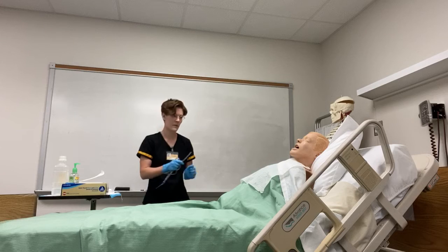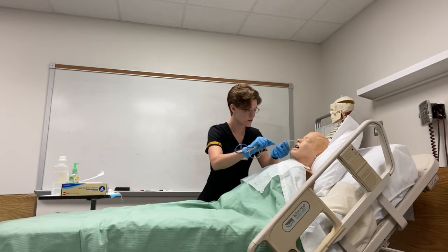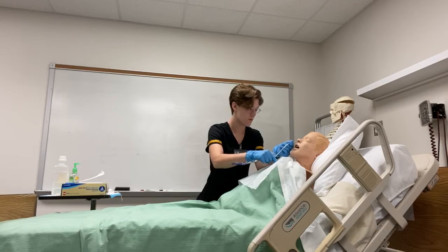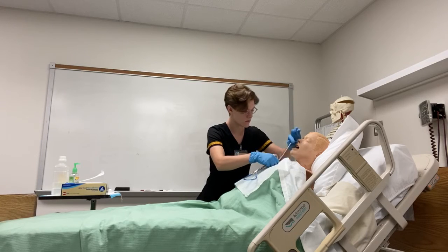Alright, so now I'm going to come back over here and I can begin inserting the tube. So I have the patient laying back. That way I can observe the pharynx. So I'm just going to, sorry about that, insert the tube. And once the tube does reach the pharynx, I would have the patient lean forward, and the patient's just going to be taking deep breaths.